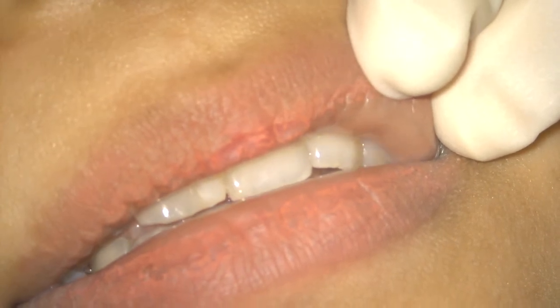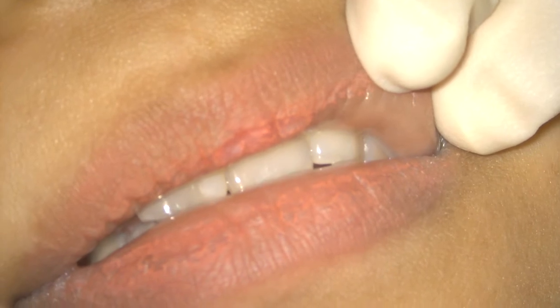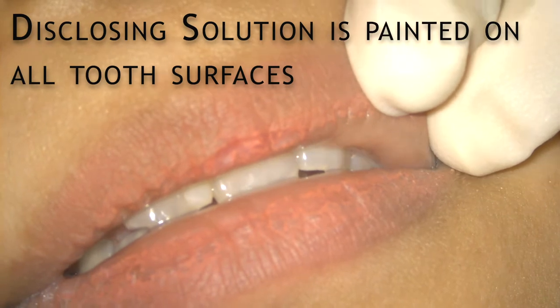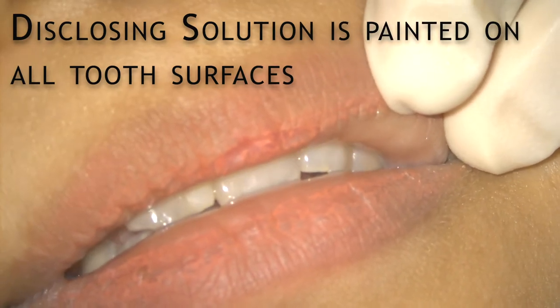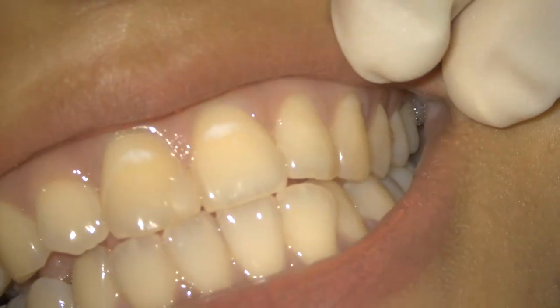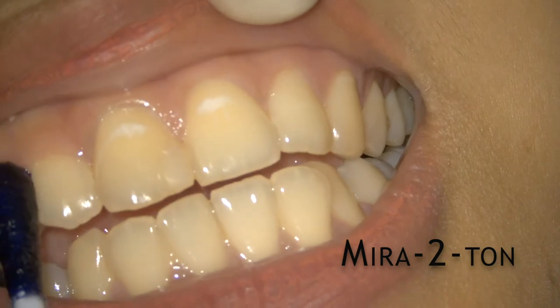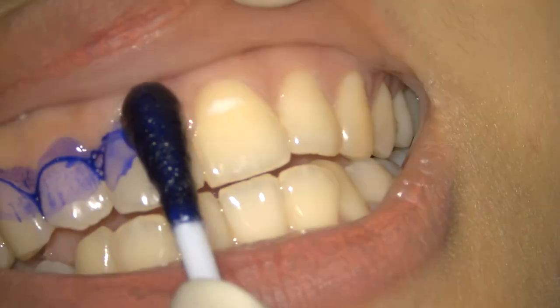Now for this O'Leary plaque index, a suitable disclosing solution has to be used and has to be painted on all the exposed tooth surfaces. Here I'm using a disclosing solution named as Nira two-tone disclosing solution. I'll explain the solution after I paint the surfaces.